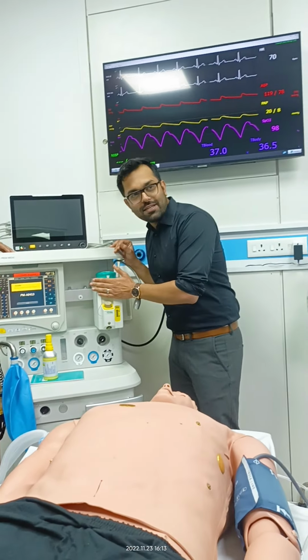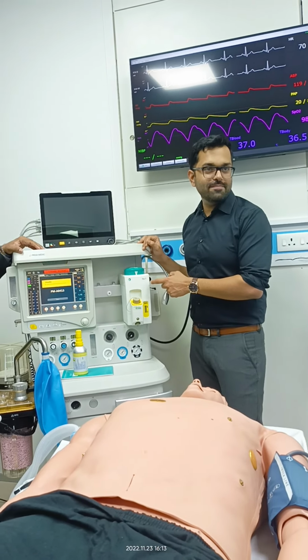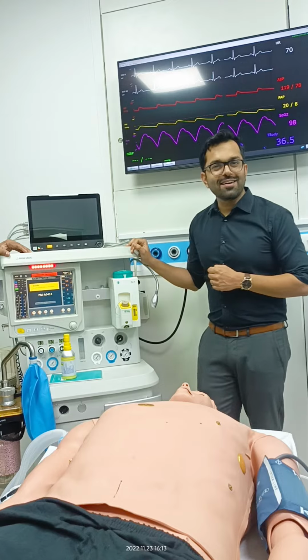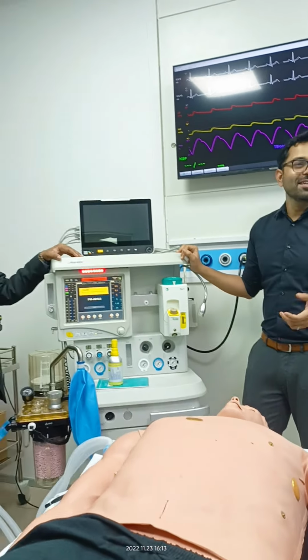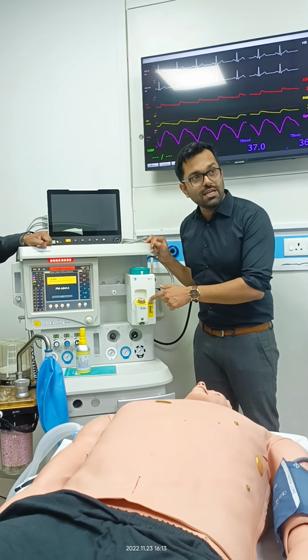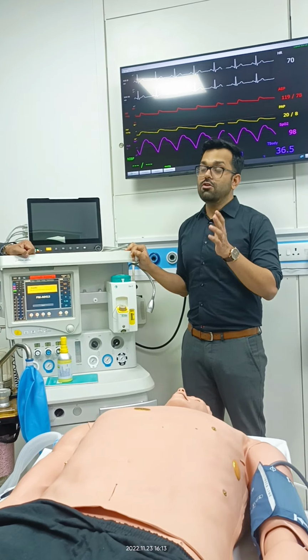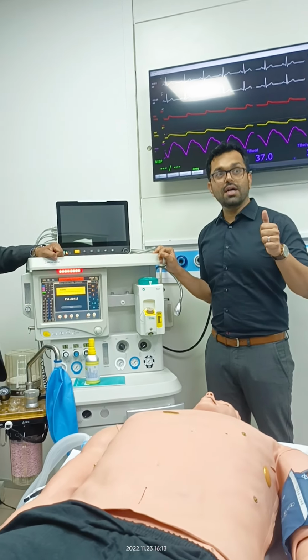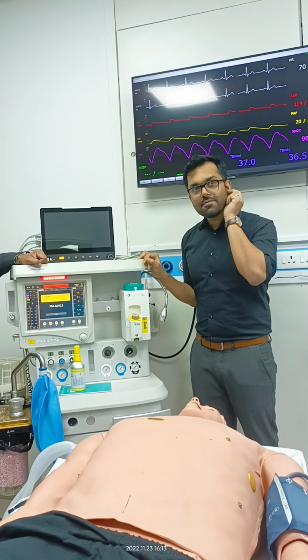So, vaporizer, and what type of inhalation agent is in this vaporizer? Sevoflurane. It's written here. Vaporizers are color coded. This one is yellow in color. Sevoflurane is always yellow in color. Then you have violet, which is isoflurane. Do you remember the MAC value of sevoflurane?